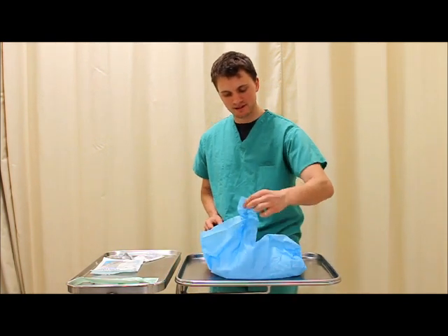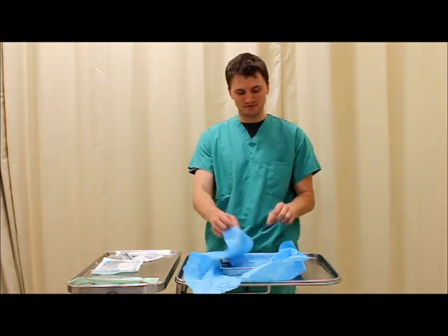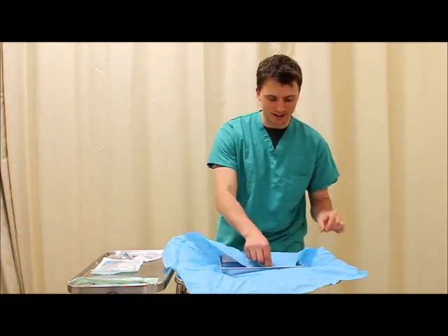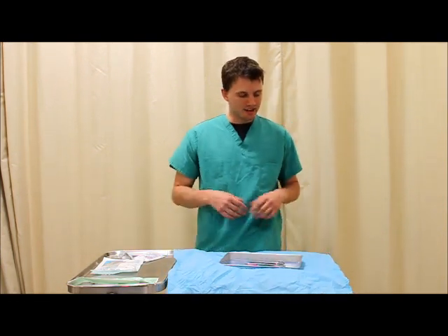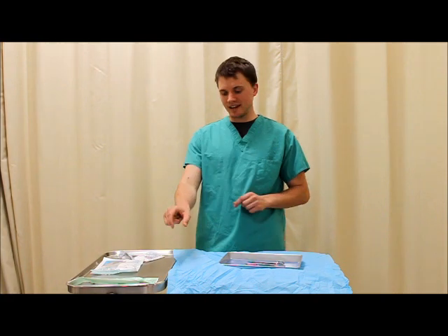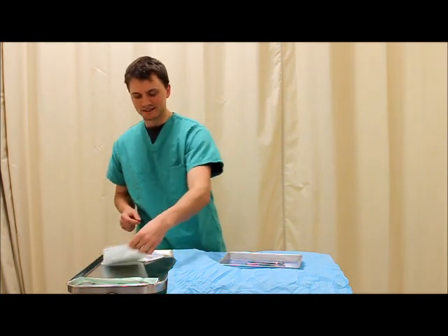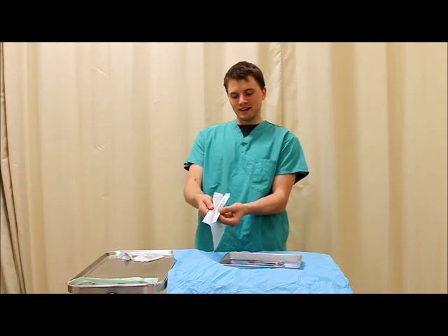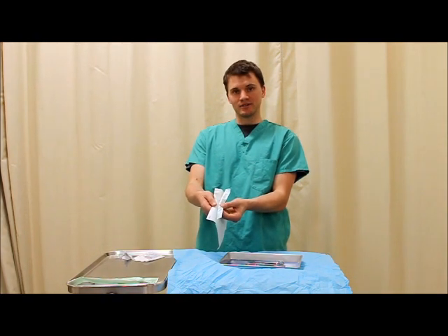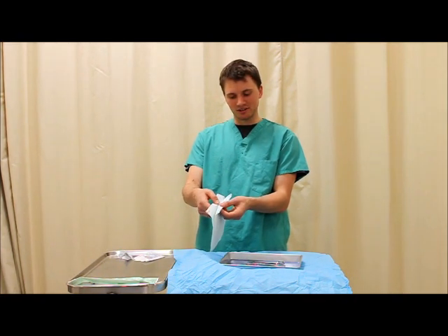It's important when you're unfolding this to start with the first fold away from you and end with the last fold towards you. Now we consider everything hanging off the tray to be unsterile and an inch around the edges to also be unsterile. Next step, we're opening up an 8x8 pad. It's important to grab the opening end where the package opens, and you can actually see the glue that surrounds it.